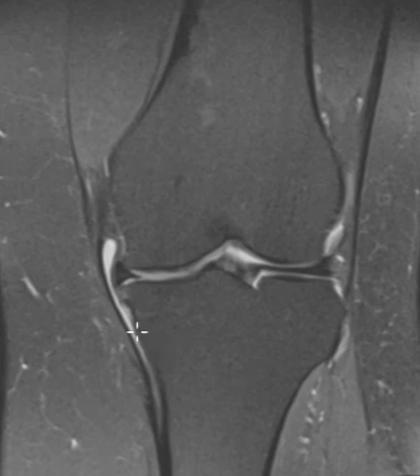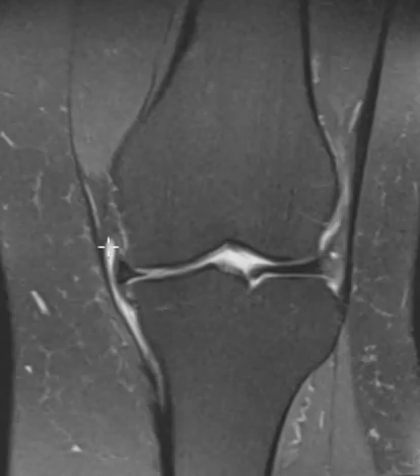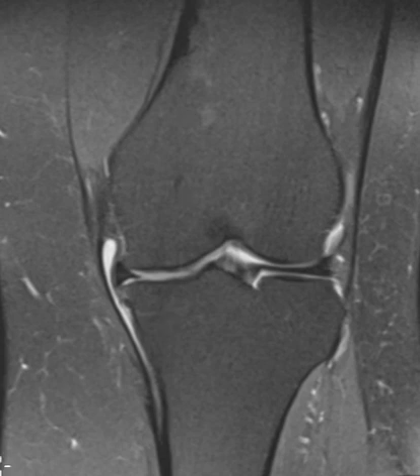And this is a potential space of bursa. It's called the medial collateral ligament bursa, or the MCL bursa, and this patient has bursitis, MCL bursitis. So this bursa is inflamed, a little bit of fluid is in there, and it separates these two components. So a case of mild MCL bursitis.